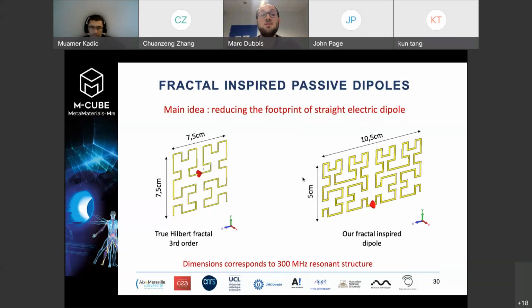So in terms of metamaterial, then B1 inhomogeneities at 10 megahertz won't be an issue, but you would use it, for example, if you want to compensate for loss of SNR, because if you have less magnetic field, the image will take more time, and if you have a coil that is more performant, then you can image faster.